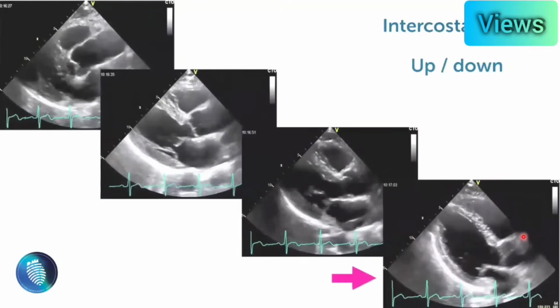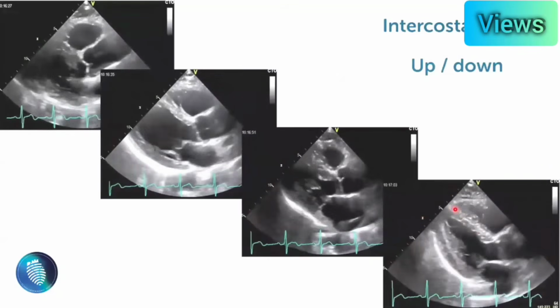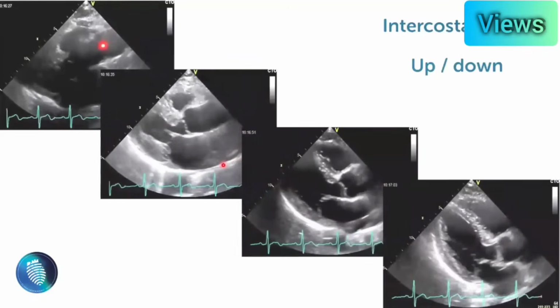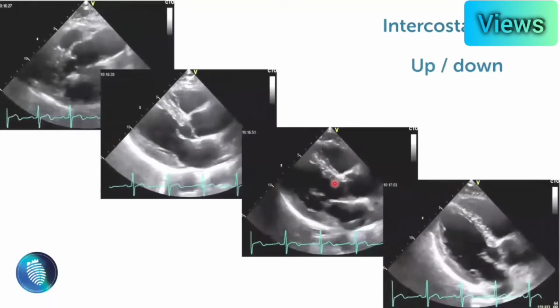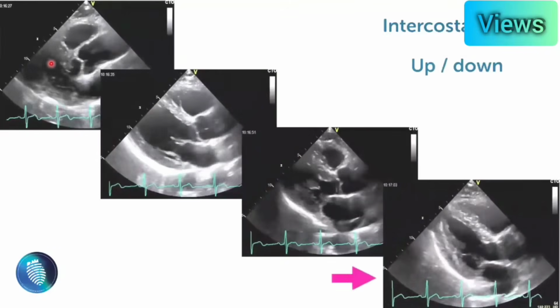So how do we correct this wrong view to the optimum view? If you notice the two videos in between, we are moving up and medially. By moving up, the septum starts to lie horizontal. The septum gradually becomes horizontal.